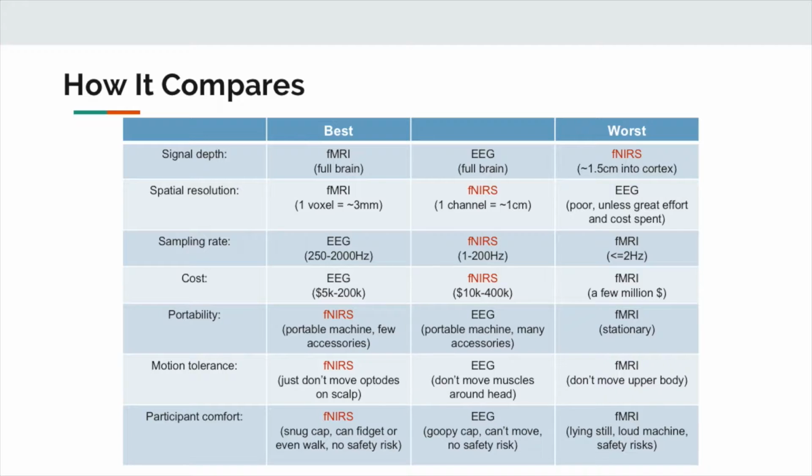And then finally, you've got participant comfort, which can be a really big concern if you're doing studies, especially in non-standard populations. One of the reasons in the 90s that fNIRS really gained prominence was because it was an ideal neuroimaging method to use on infants that you can't really put into a big noisy MRI scanner, because there's also safety concerns with MRI. You can't have certain people being in an MRI if they've had any sort of implants that would be ripped out of their body by the magnetic field.